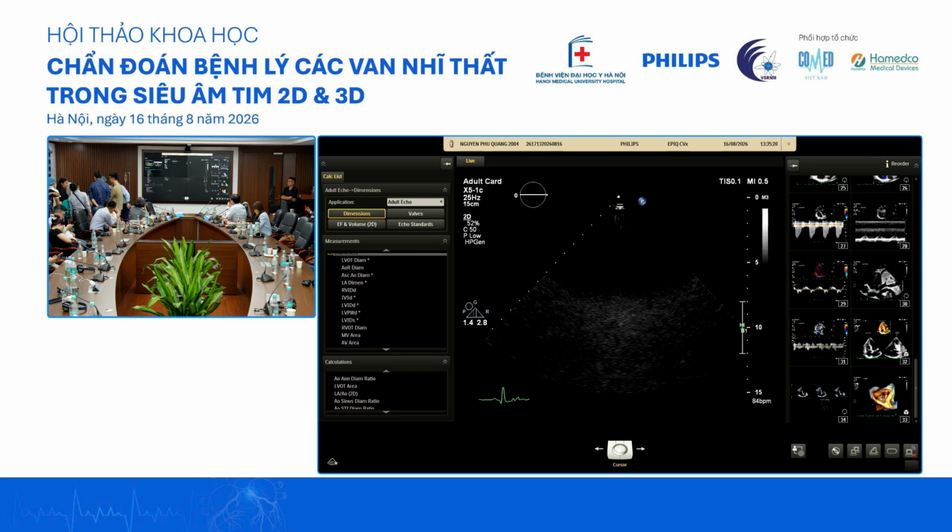Turn sideways. It's very simple. If it's functional, it tends to be central.